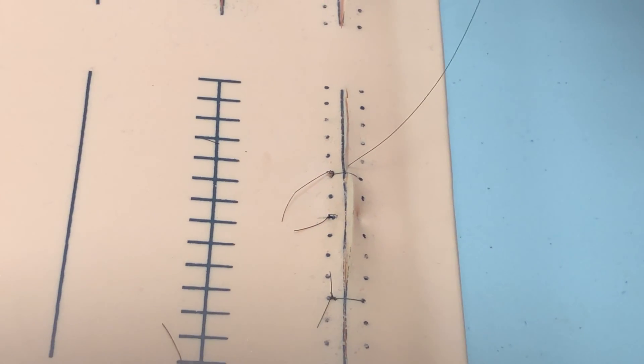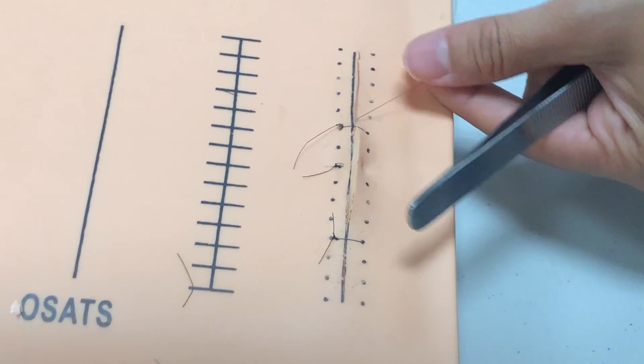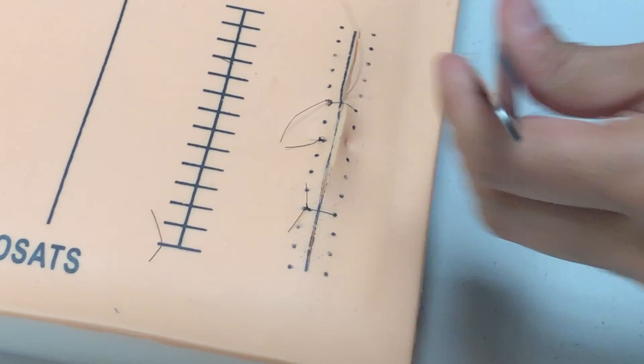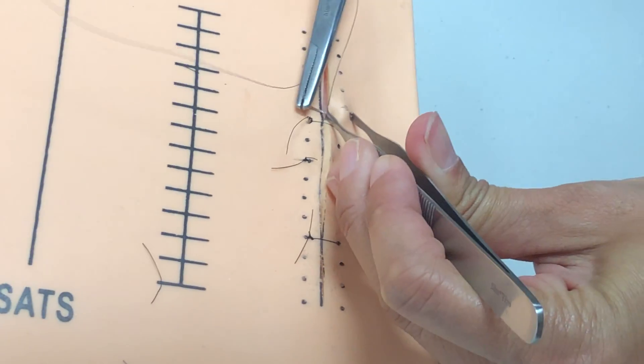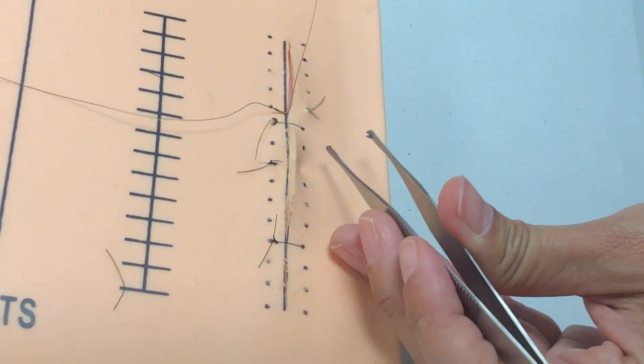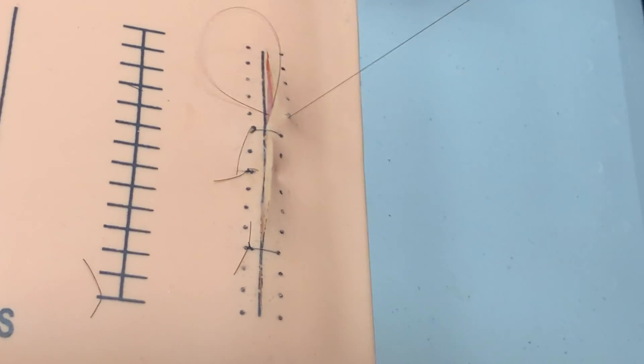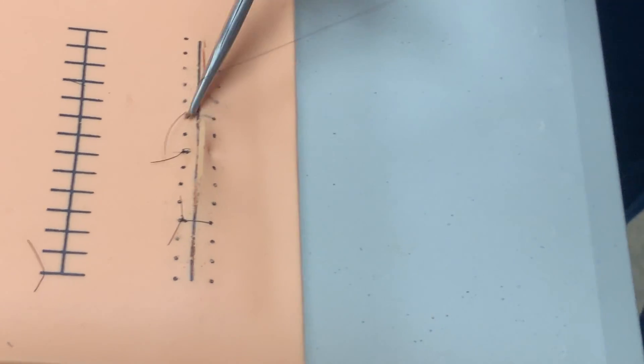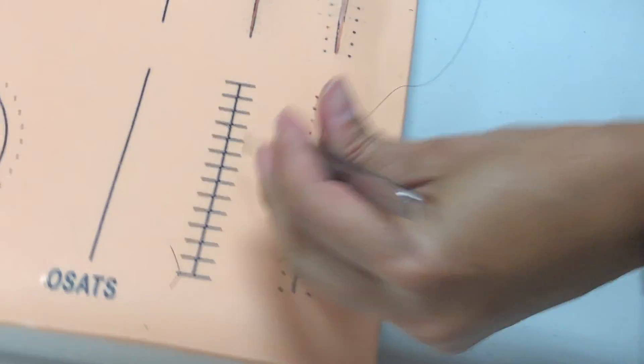Then we're going to reload and we're coming diagonally to the next dot from underneath. So we're going to grab here, we're going to come back underneath here, and we're going to pop through on that side. It's diagonal underneath the skin so that it can be parallel on top of the skin. It just looks a lot cleaner.